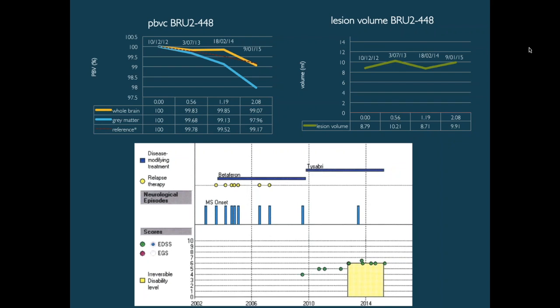You can see that this patient has had quite a few relapses, and that the number of relapses has slowed considerably over the evolution of the disease, especially in this period where he's treated with a second-line disease-modifying drug. That's the information you can see on the top third of the white rectangle showing the clinical EDMUS information. The top left of the slide shows measurements made by icometrix and plotted in orange and blue.